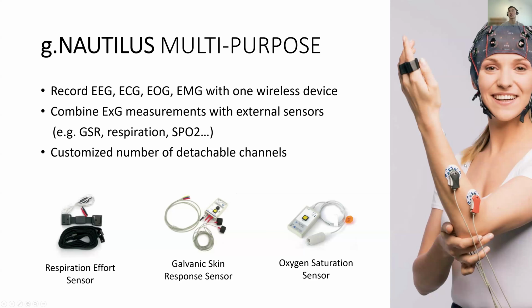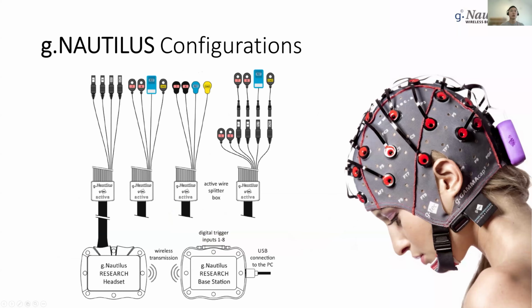Then she's also attaching the EMG sensor on her forearm. Everything is attached to the amplifier itself. So you can imagine all the signals will be timestamped automatically, really easy to use for multiple sensors.